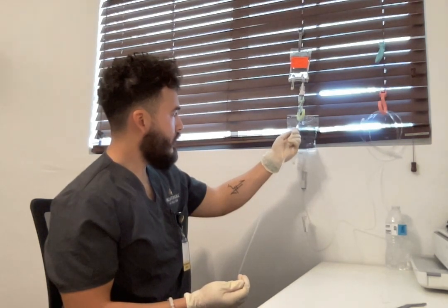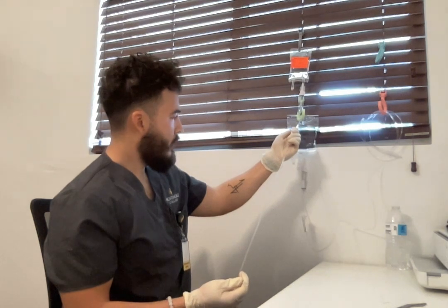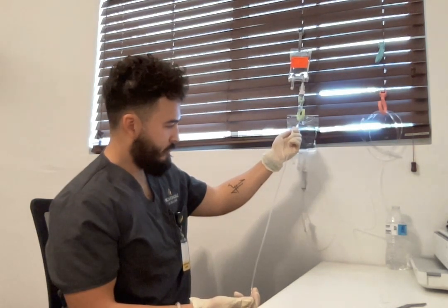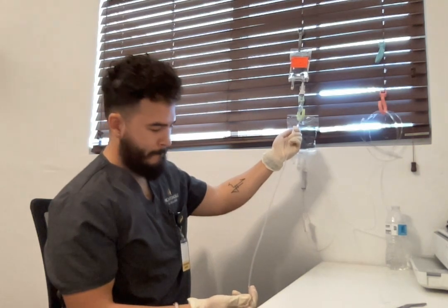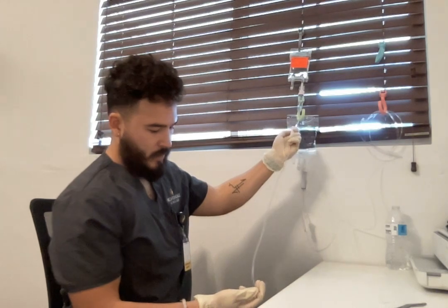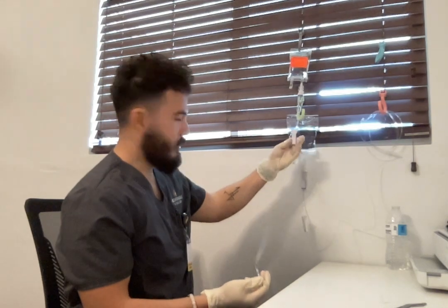So release a little more. Okay, it's flowing. Okay, I removed all the air from the lines. Now I'm going to fully clamp again.